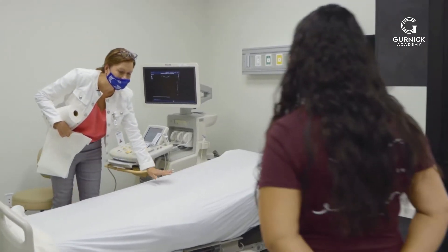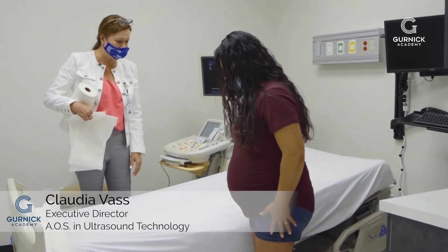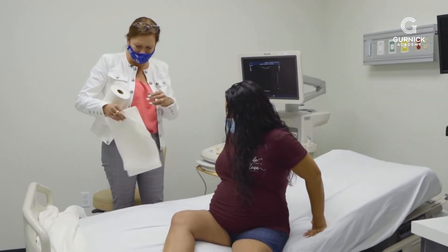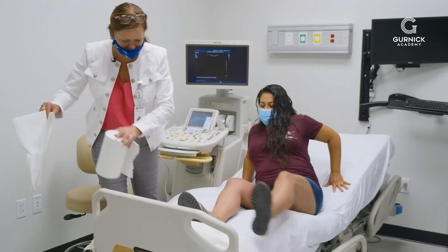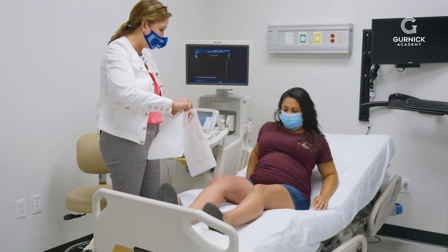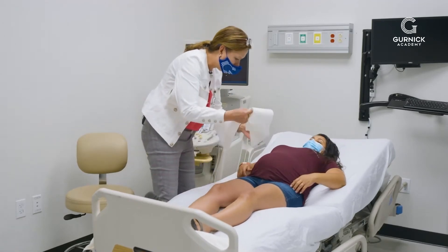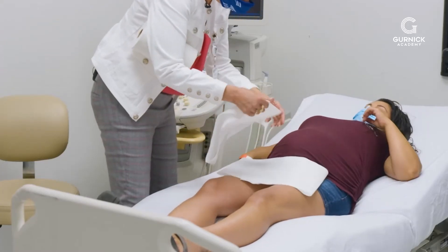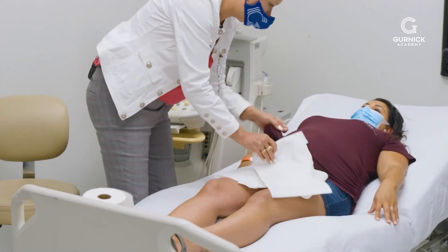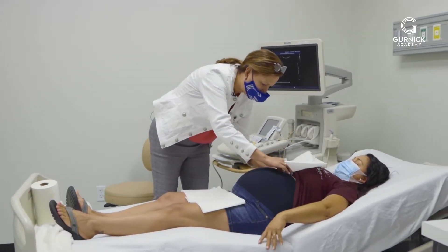Come over here and make yourself comfortable on this bed. My name is Claudia and I'll be doing your ultrasound. What's the date of your last menstrual period? Okay, so you should be about 34 weeks. I'm going to expose your belly and cover you up here. Have you had obstetric ultrasounds before? Yes, okay.